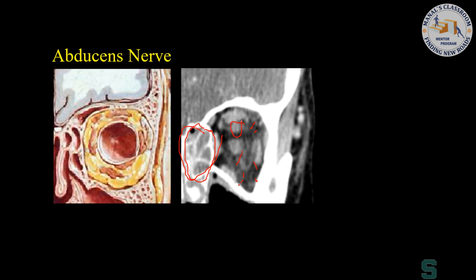See this? So I don't know about you in Egypt again, but in the emergency room, we don't get a lot of history. You know, we may get a one-word history, maybe two. I'm sure you get much better history in Egypt, right? I'm sure much better. No. So I called up the emergency room and I said, is there anything else? And they said, oh yeah. I said, what do you mean, oh yeah? They said the patient has a 6th nerve palsy.